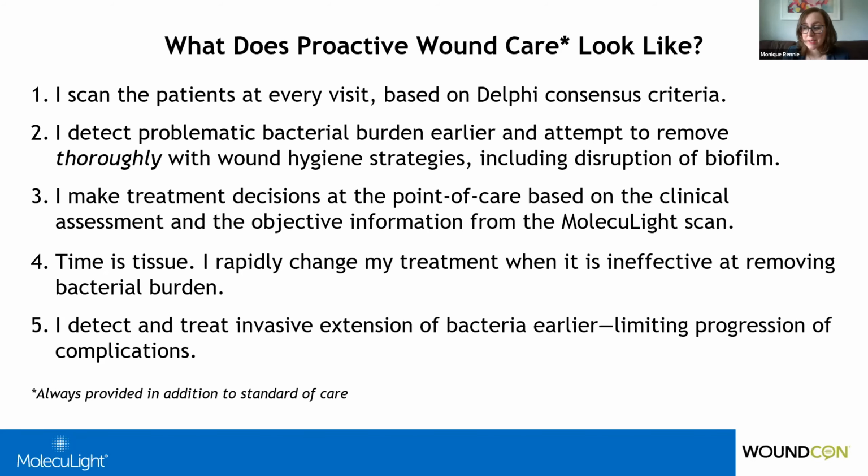Excellent. A second question, how do you manage the fluorescence imaging for detection of deep bacterial burden, for example, in a cavity or undermining? Sometimes we're surprised. I'm fortunate to have some excellent nurses that work as part of our team, but they love the scanner. They refer to it as their baby.